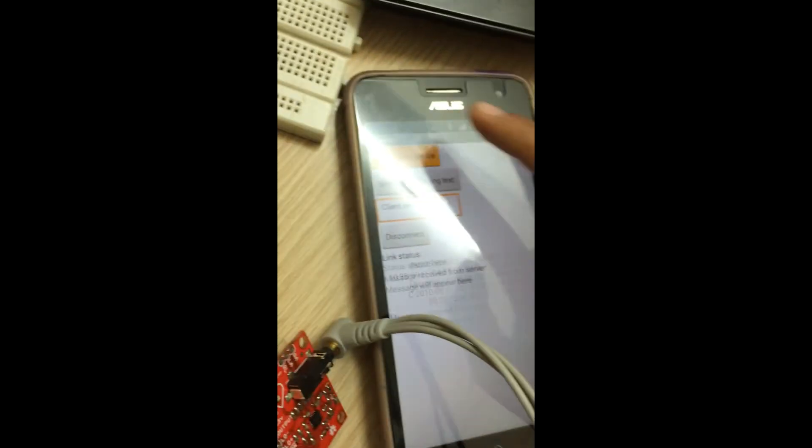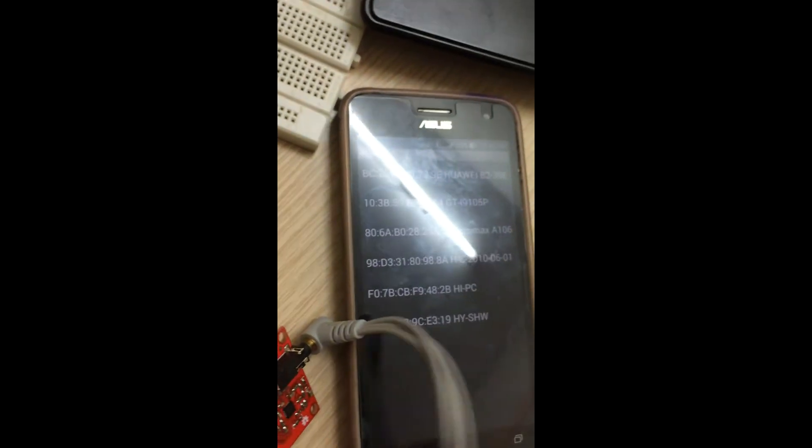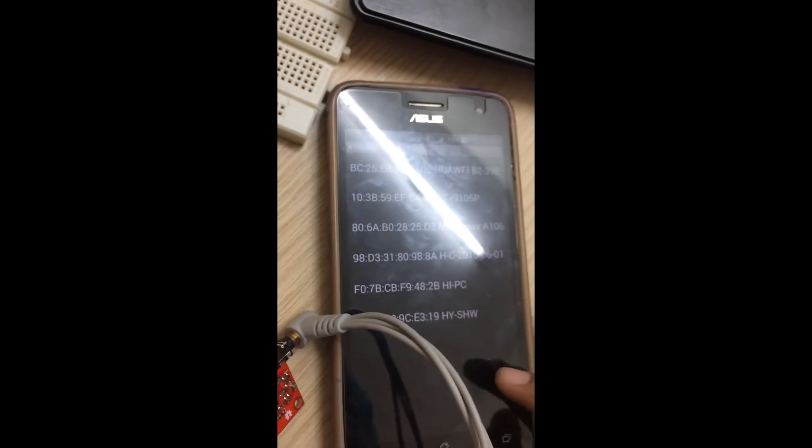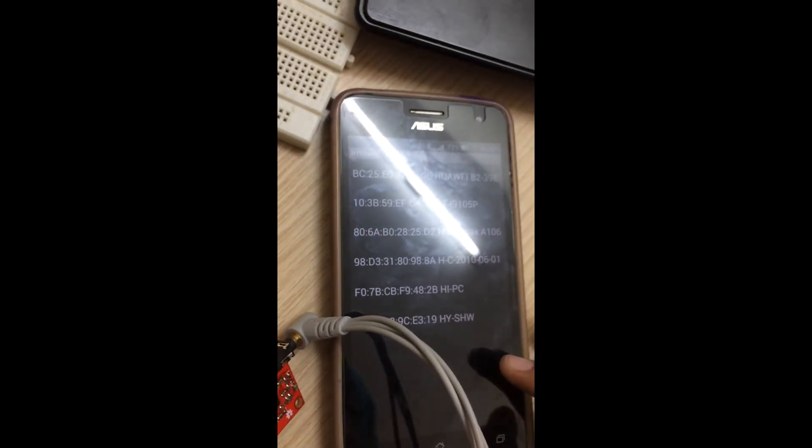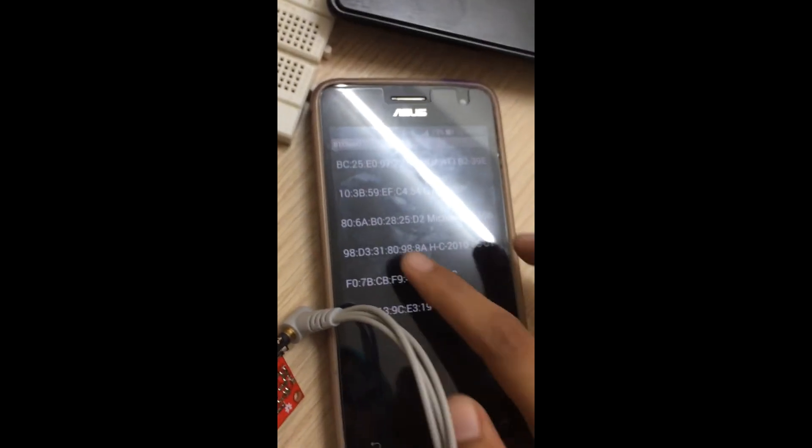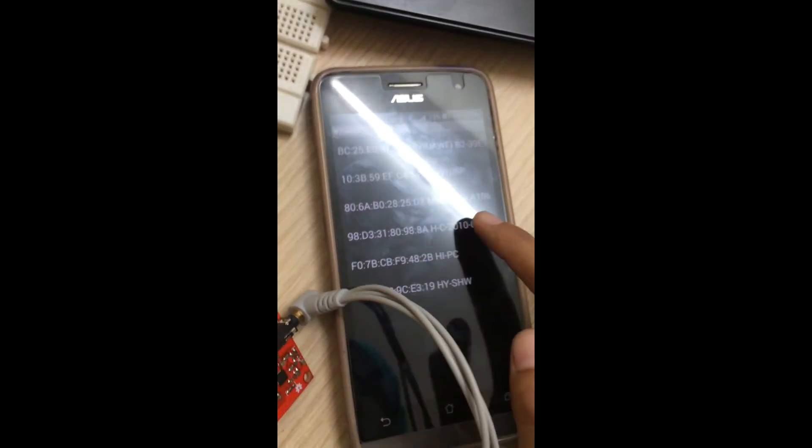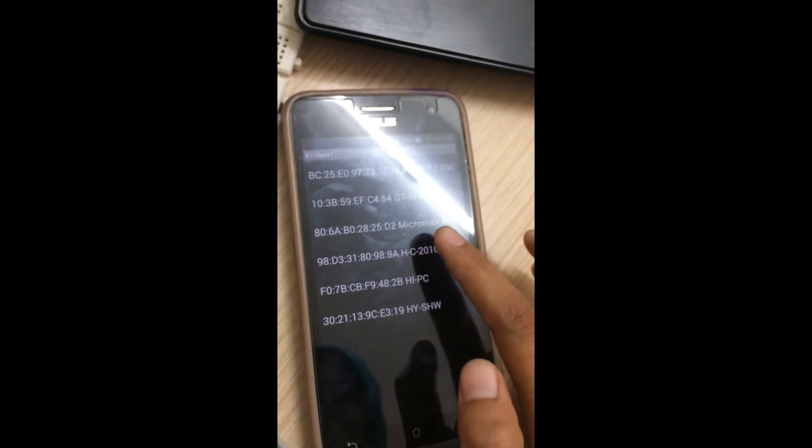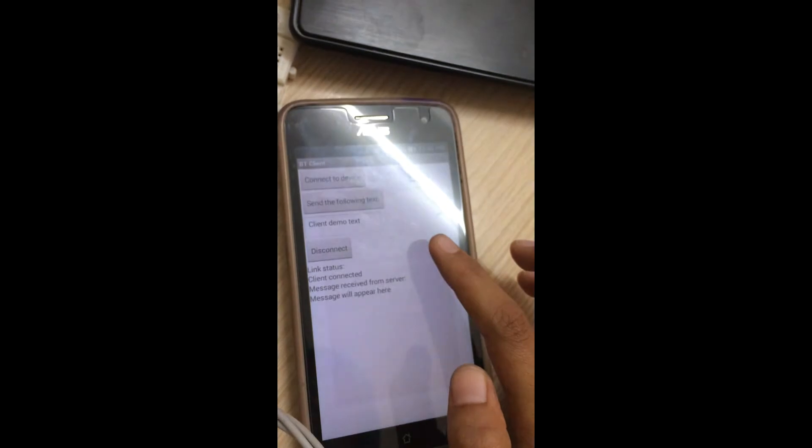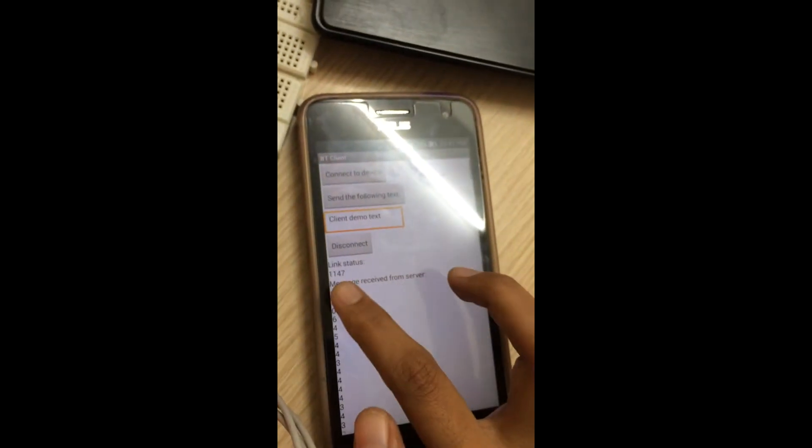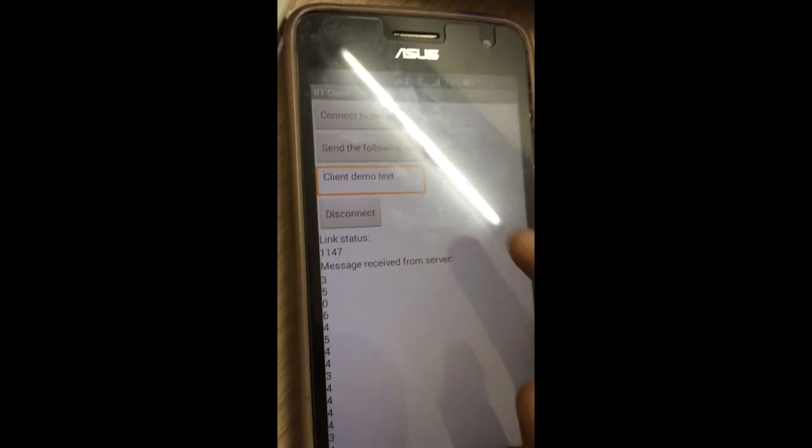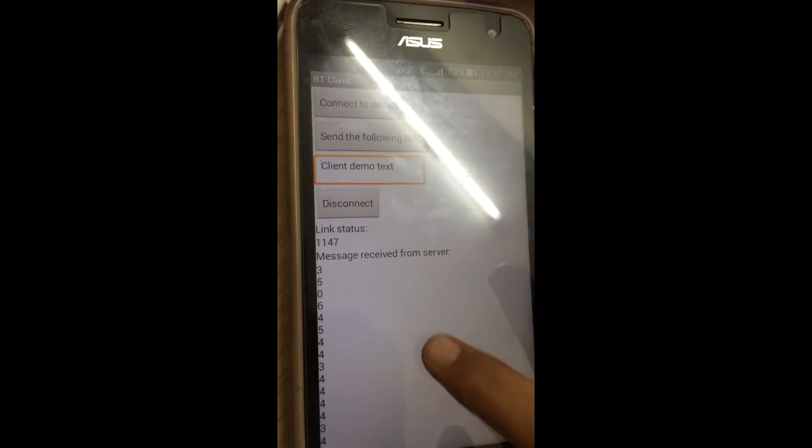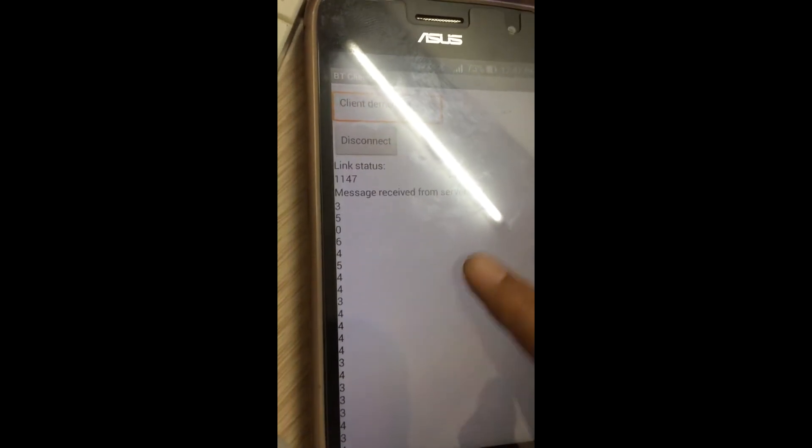First we need to connect to the device. There are various Bluetooth models available. This is HC-05 so we need to connect to this. You can see the status here: it is connected and we are getting the values which are the same in the serial monitor.